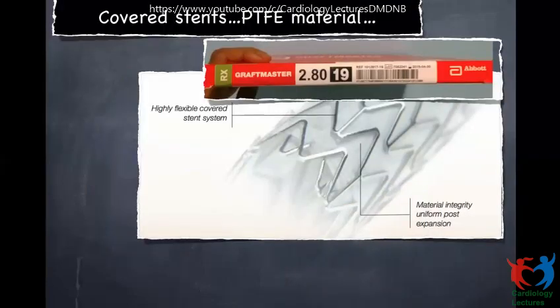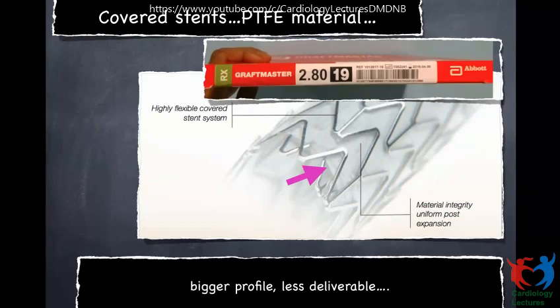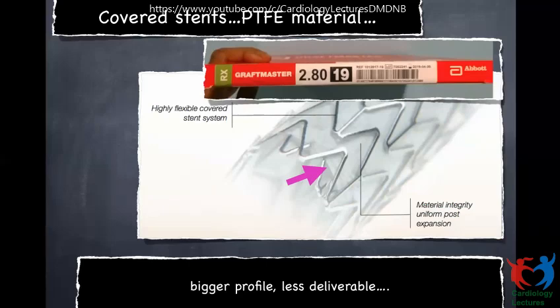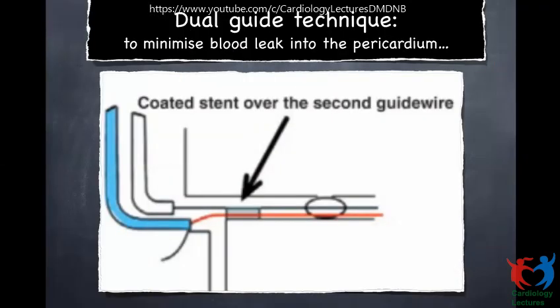We kept the balloon inflated for a long time. After deflating, the perforation was partly healing but not totally sealed. So we decided to use a Graftmaster — a covered stent going through the 6 French guiding catheter, a 4 mm Graftmaster. The Graftmaster consists of two stents with PTFE material sandwiched between them, making it a bulkier, less deliverable device — but this stent has saved many patients following perforations.